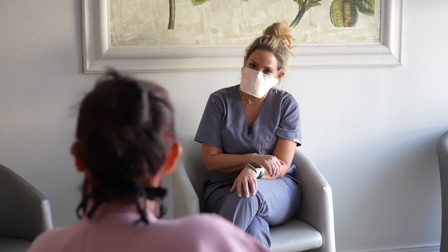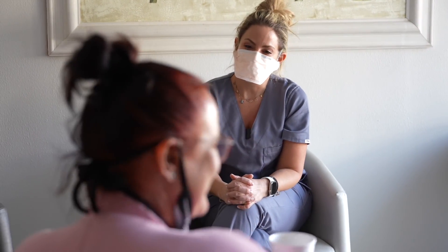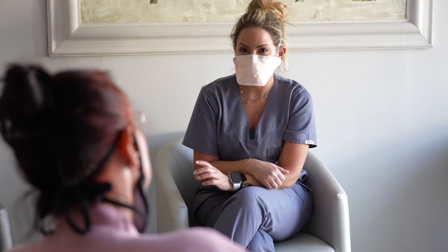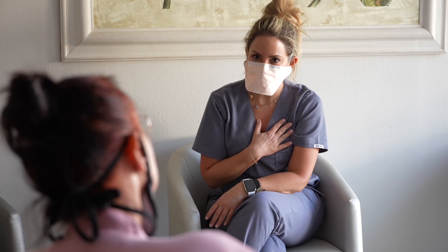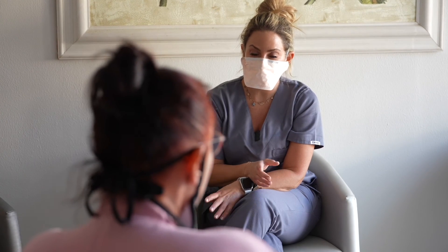All aftercare is explained to the patient in detail. No physical exercise for 24 hours. Some pain or discomfort is expected. Paracetamol is advised as opposed to anti-inflammatories or aspirin. If excessive swelling or bruising occurs, an emergency contact number is supplied to the patient so that the treating physician can immediately be informed. A follow-up appointment is arranged within a week to overview the results.